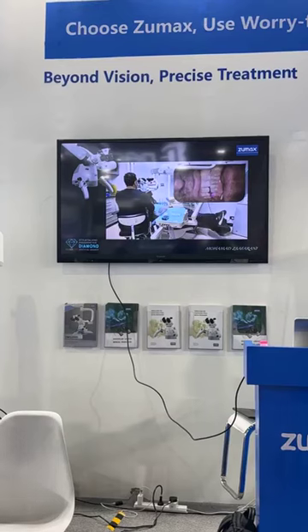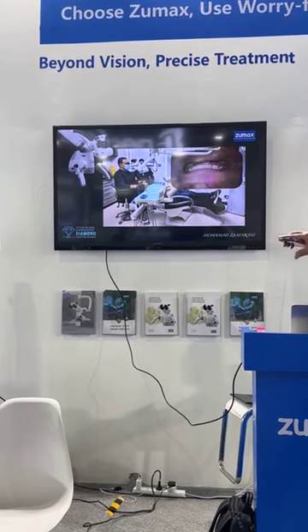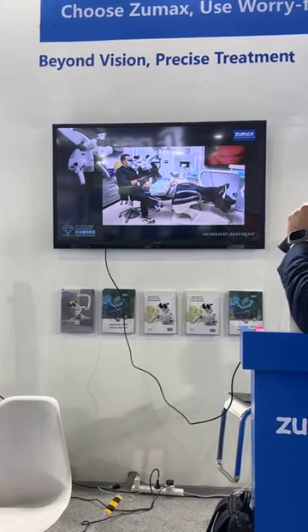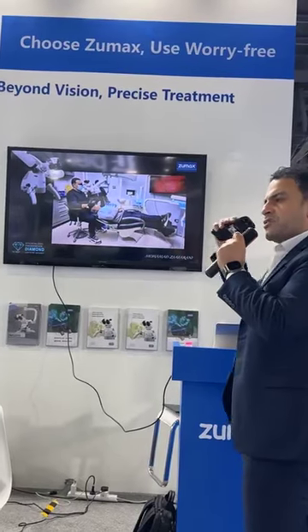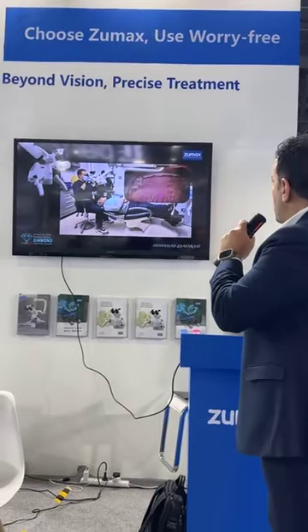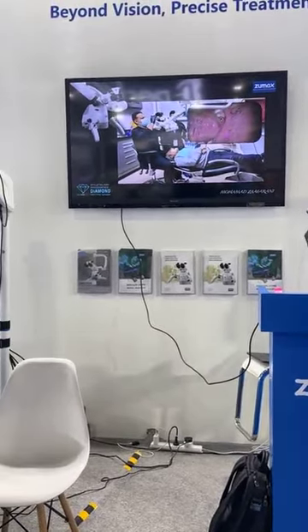When examining the upper and lower position, the patient is almost at 180 degrees. And don't move the microscope. Control the patient's position and keep the microscope in the right relation. You can move the patient or move to the left. And here, you will see that you can access any part of the patient's mouth from this position.